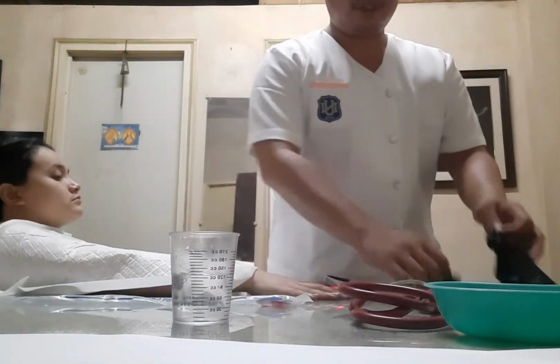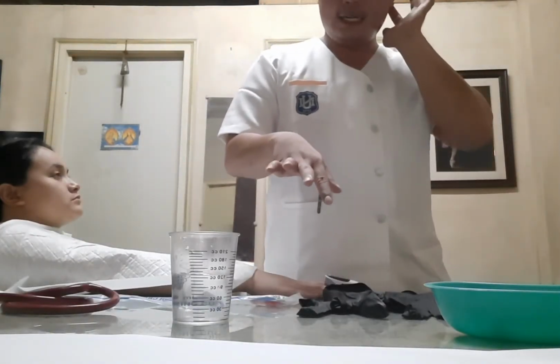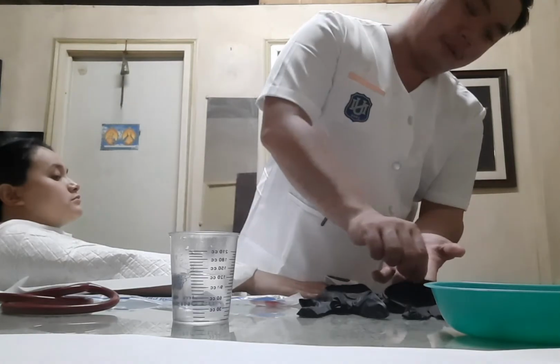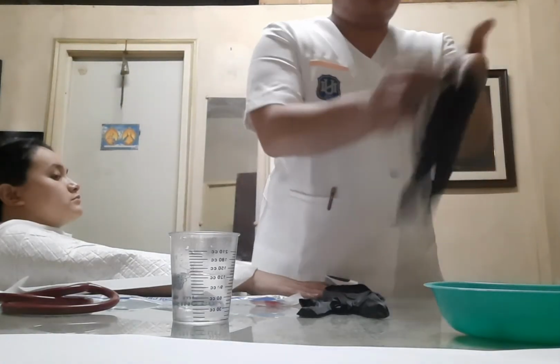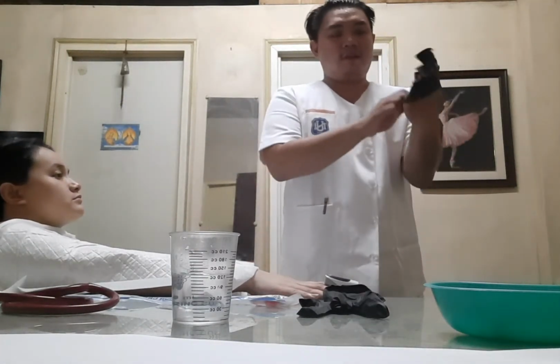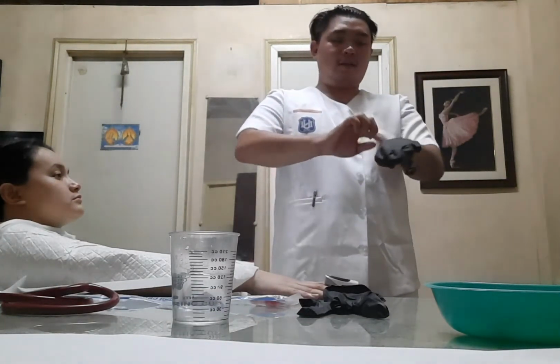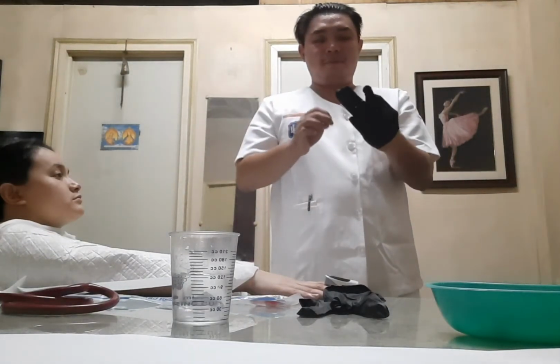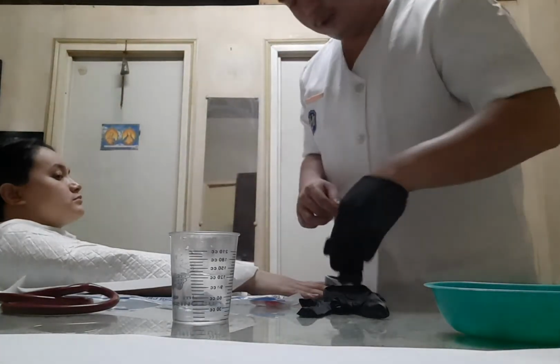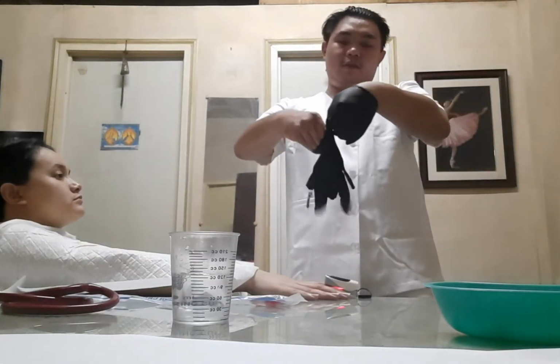Assuming that I already opened the sterile gloves, I will be done gloving and step back into my working field, and don't put the hand below your waist level. So, from sterile, step back out to the working field.